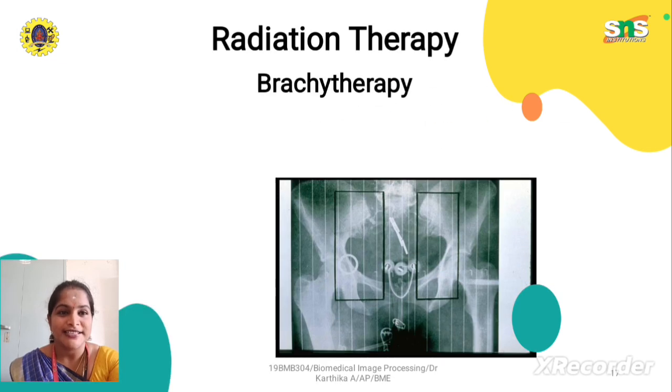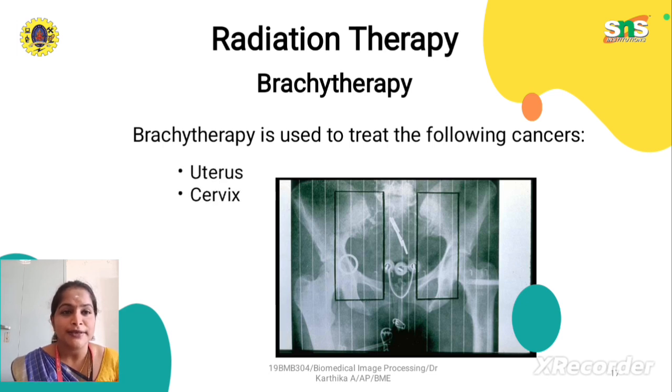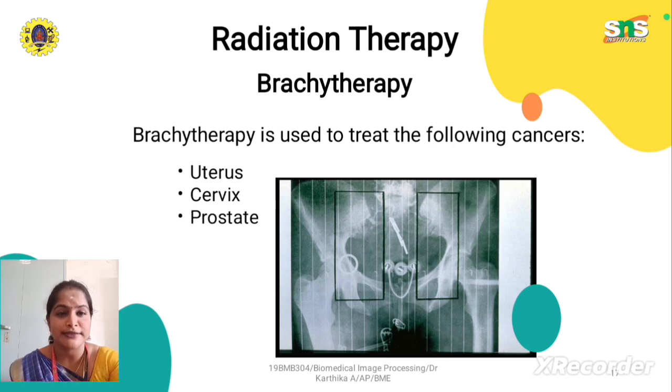Okay, see the radiation therapy diagram. Brachytherapy is mainly used to treat the following cancers: uterus, cervix cancer, prostate cancer, intraocular cancer, skin cancer, thyroid cancer, bone cancer.